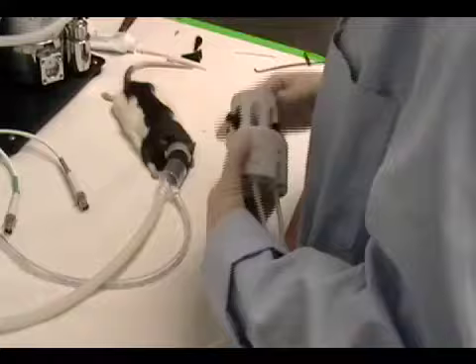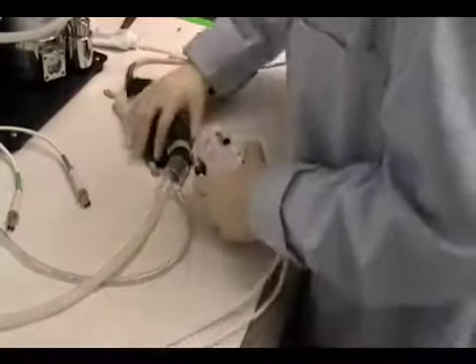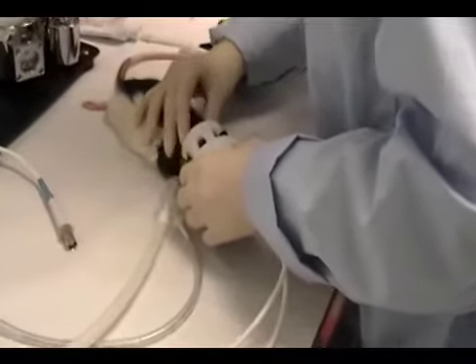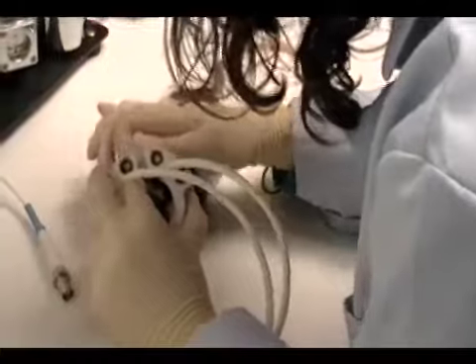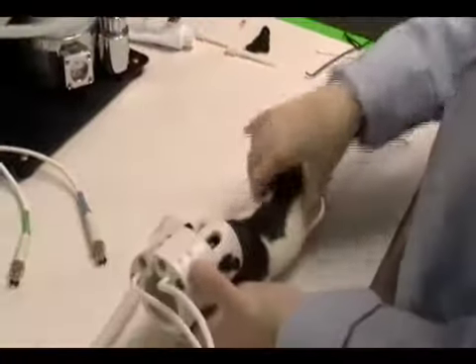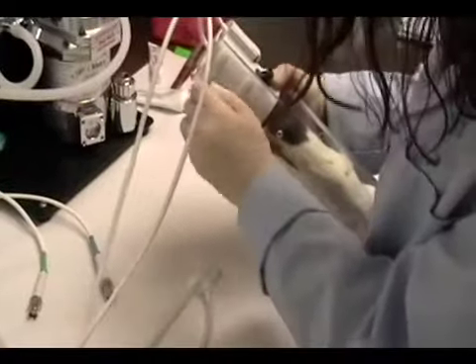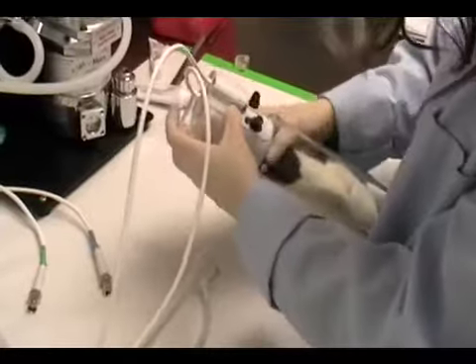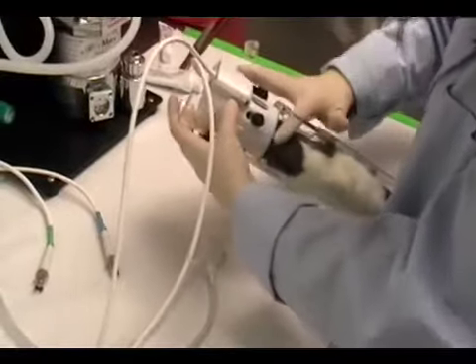The animal's head is then positioned into the quad coil. Its mouth sits over a bite bar, with a nose bar that secures it in place. The researcher then attaches two screws to the quad coil to make contact with the head bar and holds the animal's head in place. The rat is placed inside the body tube, and the quad coil is attached to the body tube through a two-screw locking mechanism.